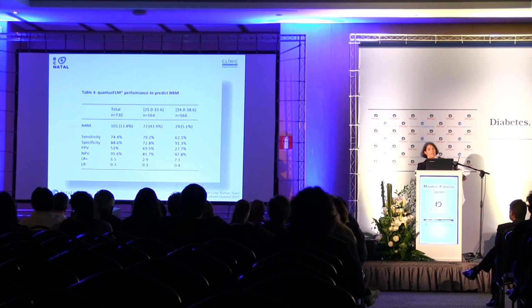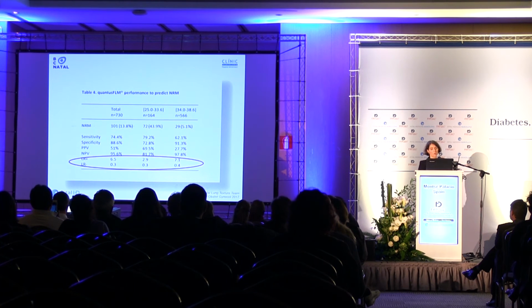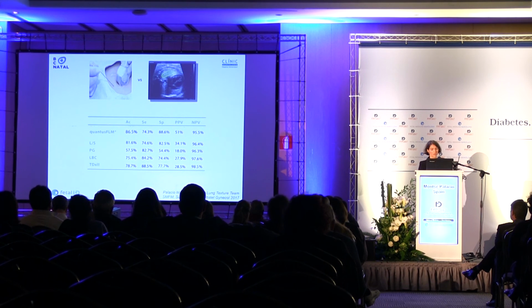So with this tool, we got numbers of performance of this tool to predict respiratory morbidity. And what is actually important is that if the test was positive, the basal risk could be increased. So you knew that this baby had higher risk of respiratory morbidity than you were expecting for the gestational age. And if the test was negative, that would decrease the real risk of this baby. So you could use this in your clinical practice.